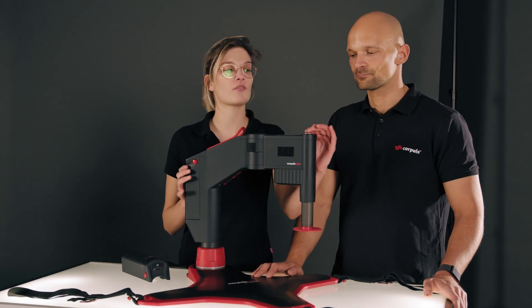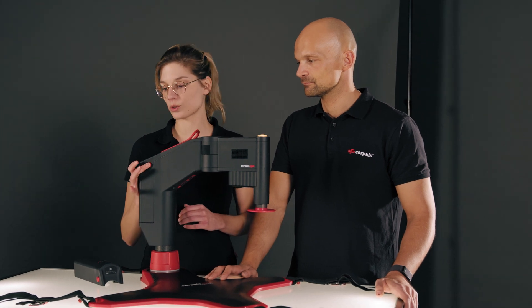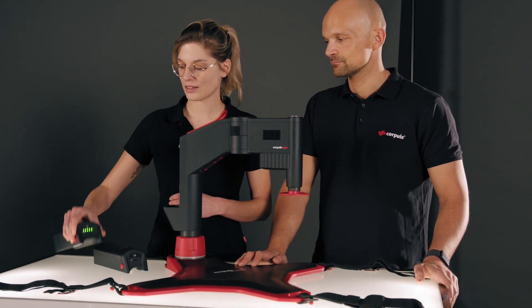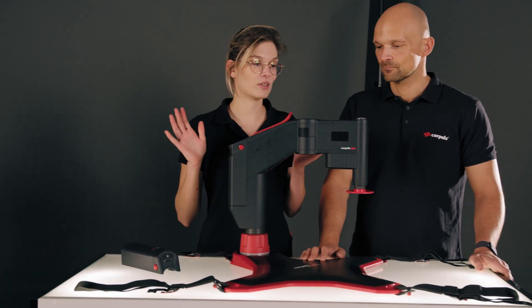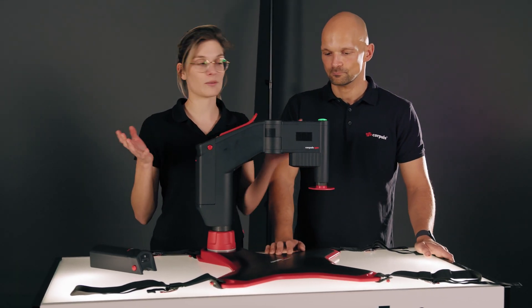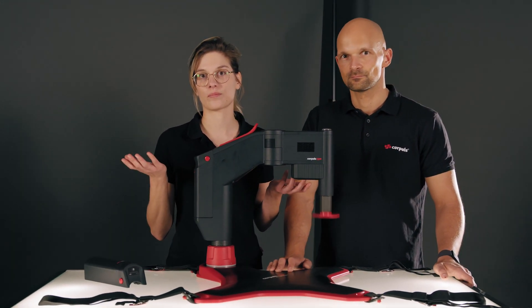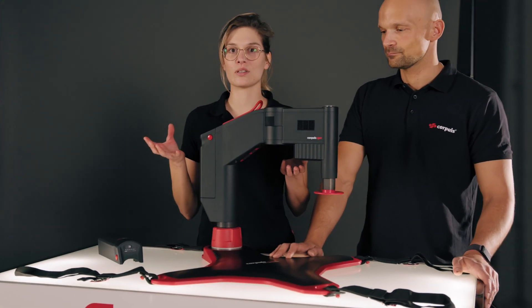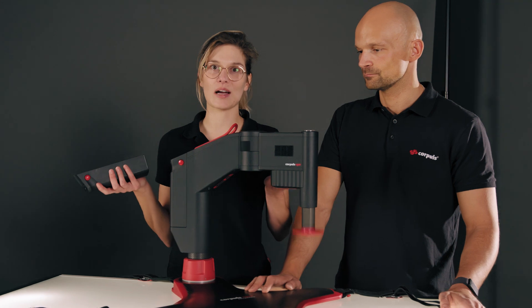I can simply pause the therapy, remove the battery by pressing the two red buttons, and insert the new battery. The device then automatically starts up again and I can immediately continue the therapy. I have 30 seconds to do this, but if I have the battery ready beforehand, that's more than enough time.